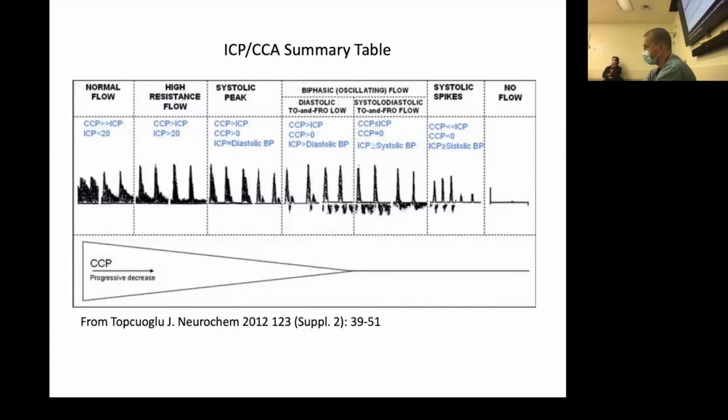The American Society of Neuroimaging, to challenge their examinations, suggests that you have to do 100 independent transcranial Dopplers with your own interpretation, overseen by someone trained in transcranial Doppler, to be able to write their exam. I found that probably 100 wasn't enough, to be honest with you.